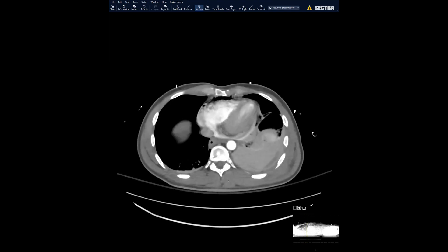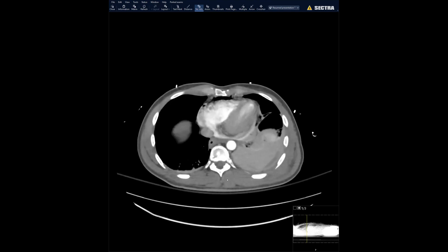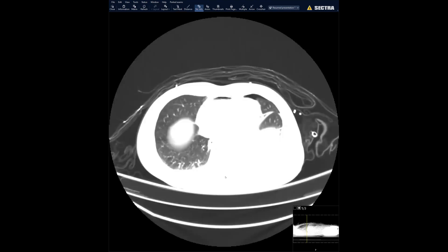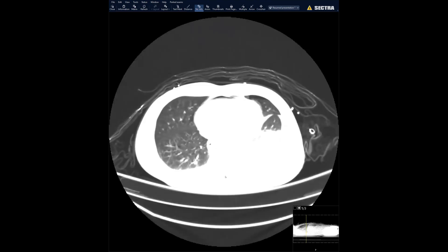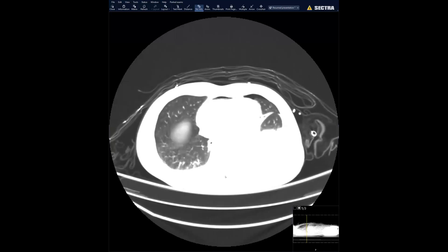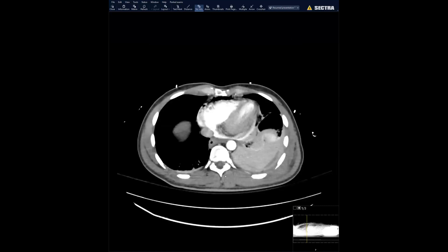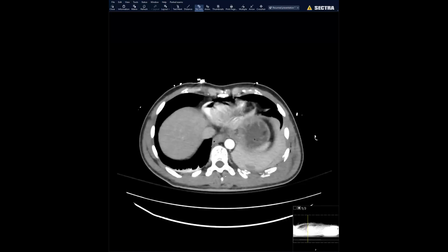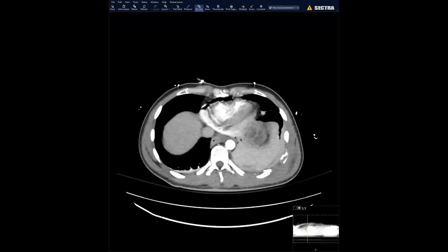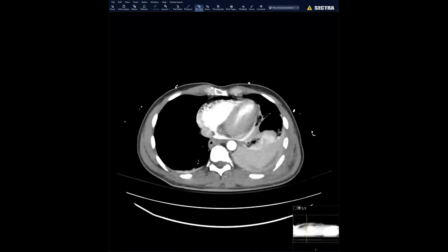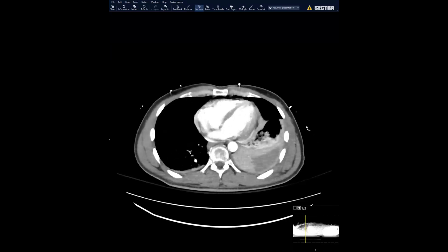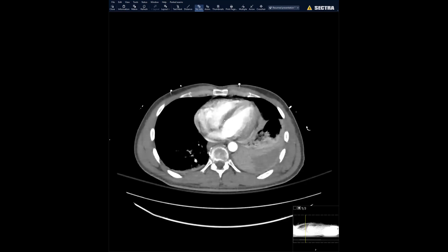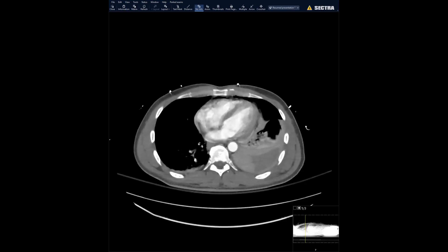On lung windows there's pneumothorax and pneumomediastinum. I'll keep scrolling through these images to see if you pick up other stuff, windowed a little, and I have a venous phase also to show.